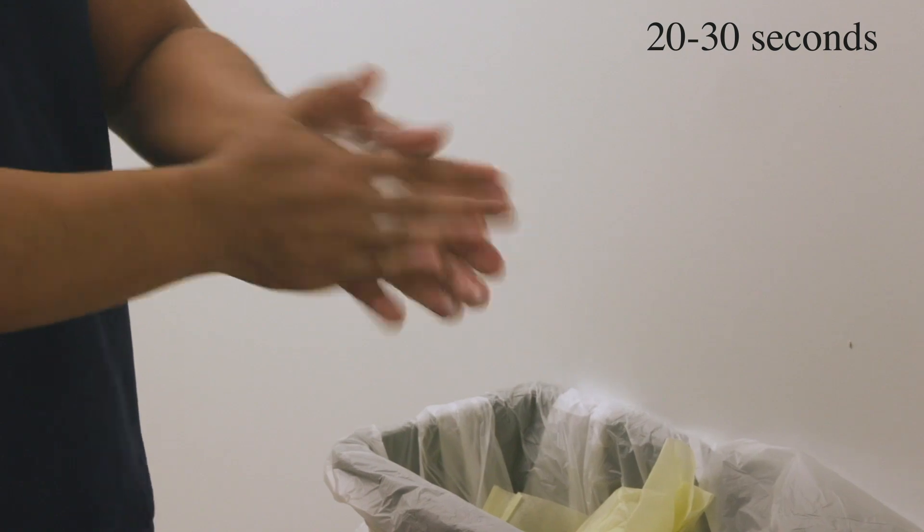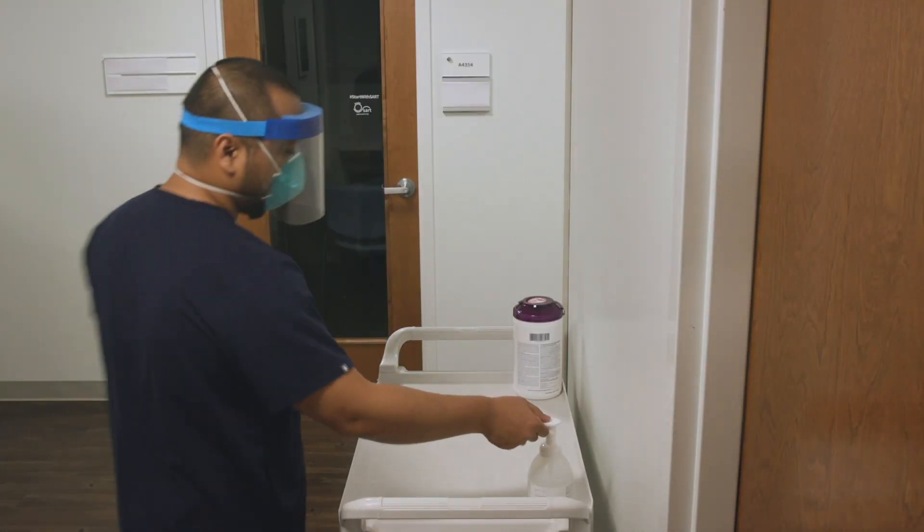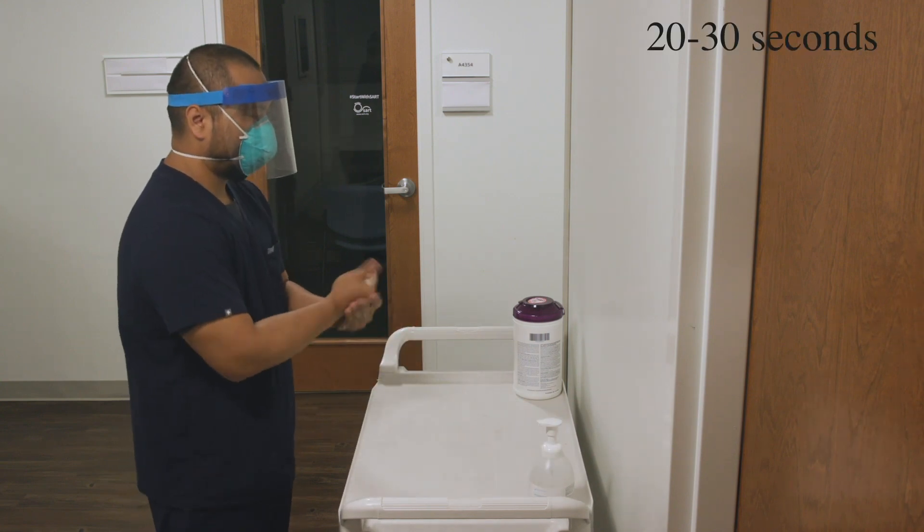Sanitize your hands very, very well. Now exit the patient room. Sanitize your hands very, very well.